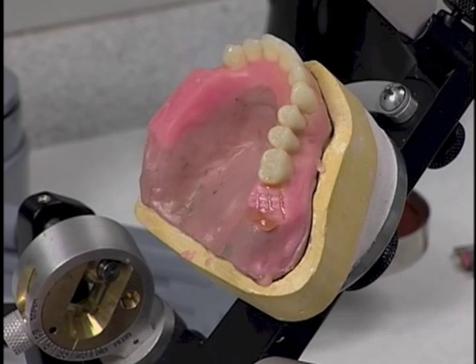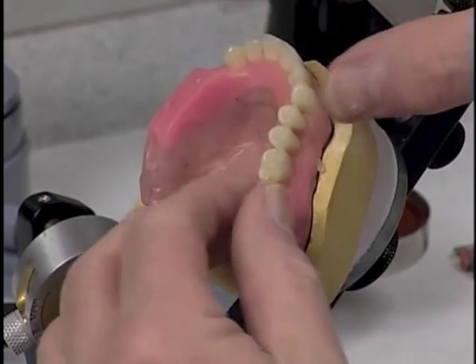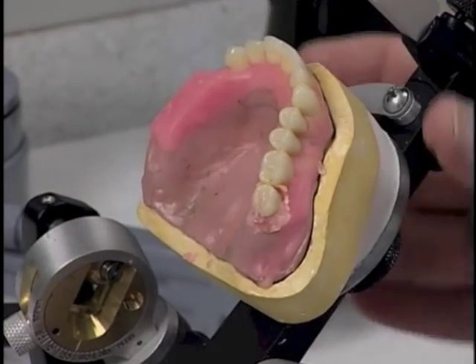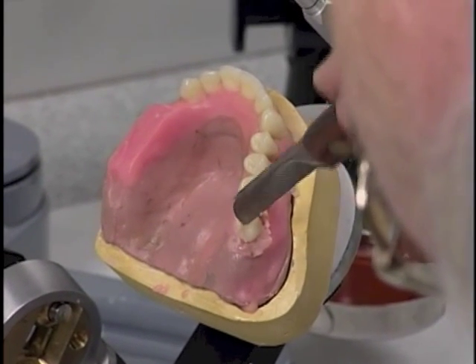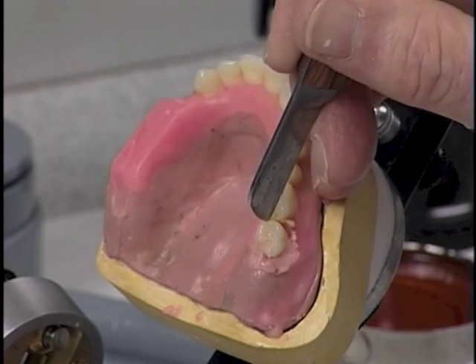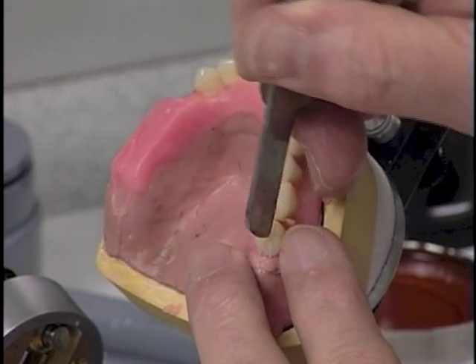So now we're going to place that maxillary second molar, and as you can see, we got some wax in the occlusal, which will hinder the proper arrangement of the tooth. So we'll clean it up a little bit.